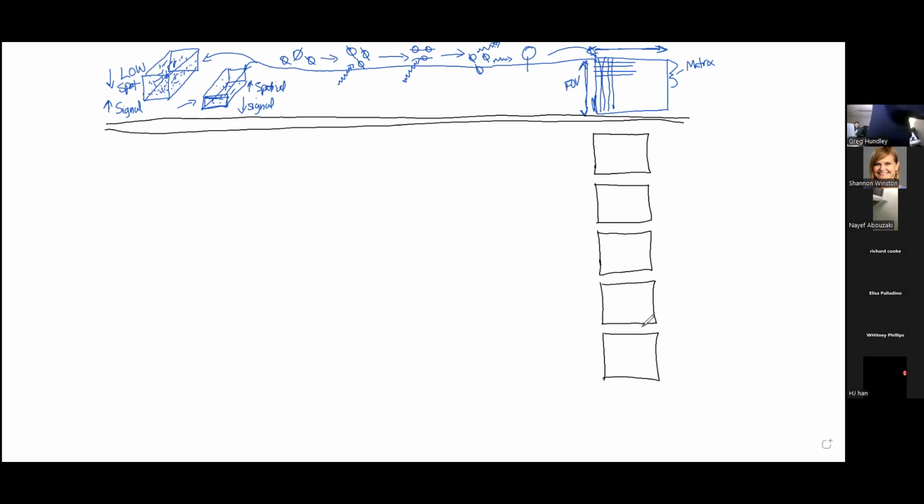So the first frame might be end diastole, and here's our LV, nice and large. Then as we move through the movie and play those cine images, we get down here to end systole.